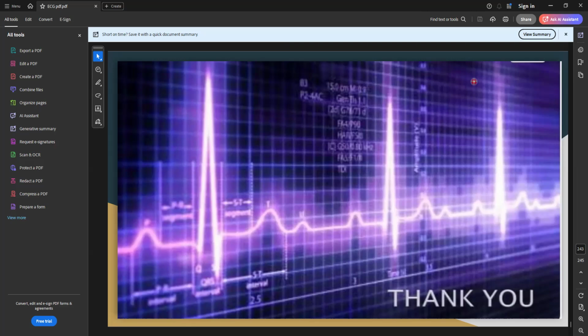Most commonly important diseases you can identify with the ECG are the arrhythmias. It can be atrial arrhythmias, bradyarrhythmias, tachyarrhythmias, ventricular arrhythmias, ventricular tachycardia or ventricular fibrillation, where you require immediate intervention.